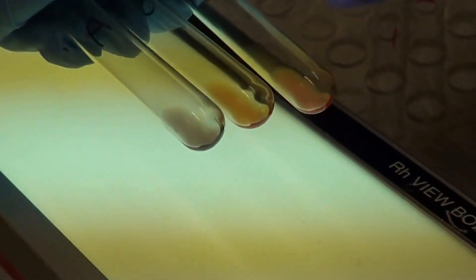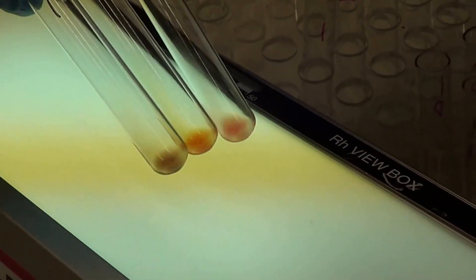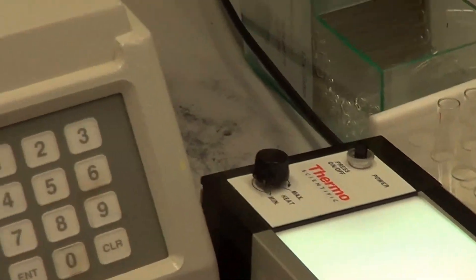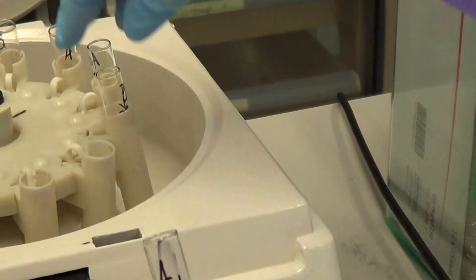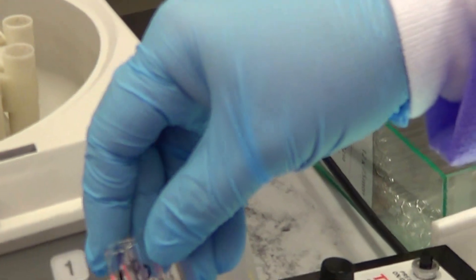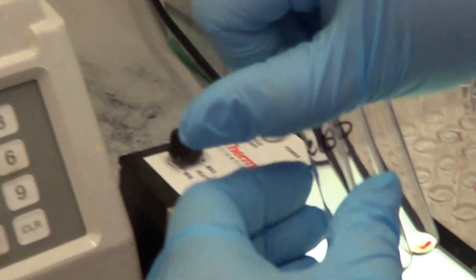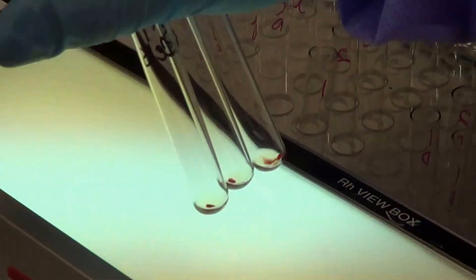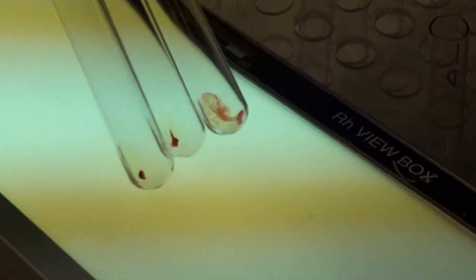To confirm your type, you perform a back type or reverse typing. If you have type O blood, the naturally occurring antibodies in your sample should be anti-A and anti-B, so those cells should agglutinate.